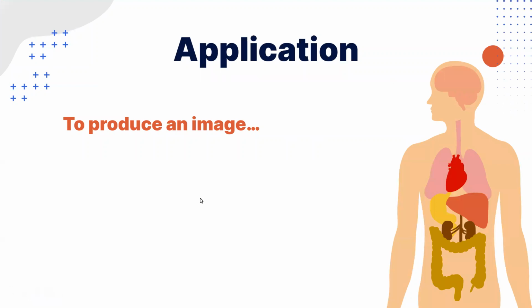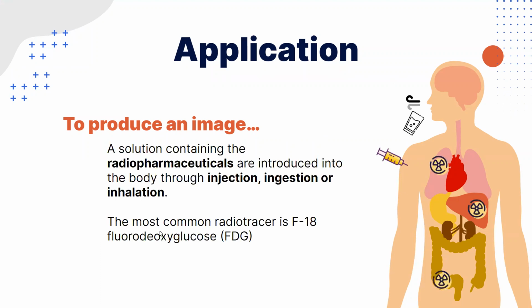Thank you, Lisa. So to produce an image, a solution containing the radiopharmaceuticals is introduced into the body through ingestion or inhalation, and uses radioactive tracers to produce images of the body for diagnostic purposes, which I will discuss shortly.